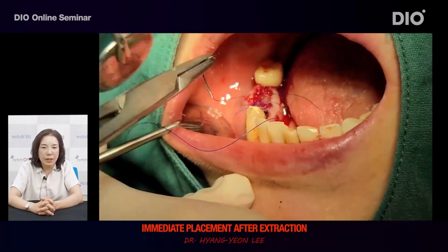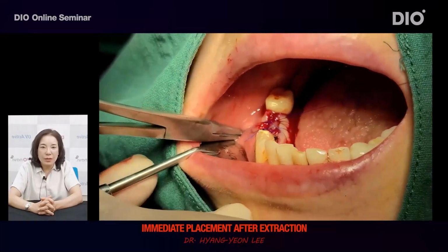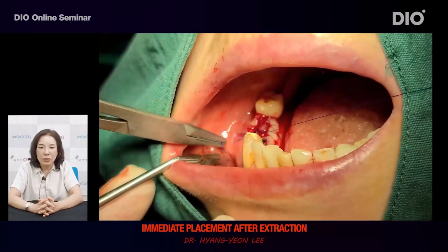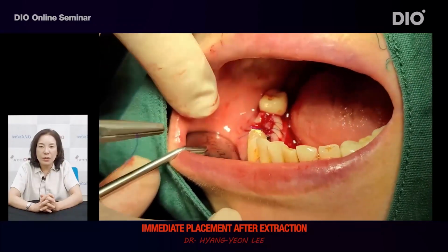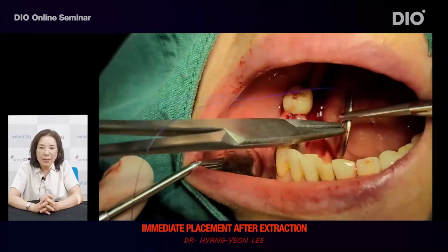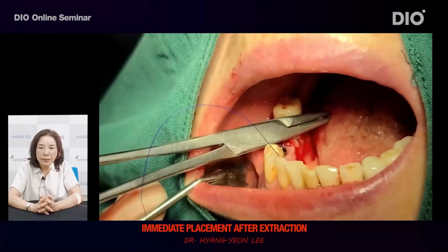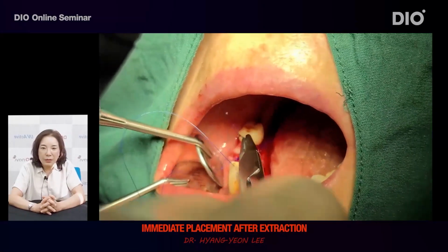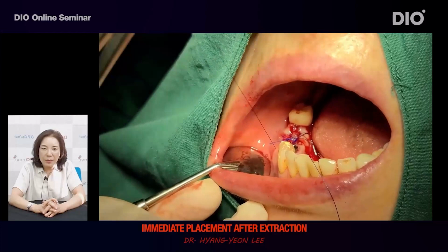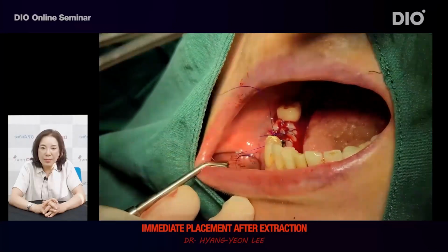I believe this triangle suture is highly efficient in suturing the relevant area after immediate placement after extraction. It is a highly effective and more useful suture method in gathering the gum than individual sutures. Check for the presence of gaping gum and perform more sutures if necessary. Since it is a suture that contains simply the tooth extraction socket rather than performing an additional incision, there is no problem that can be anticipated as you only need to perform suture in as-is condition.